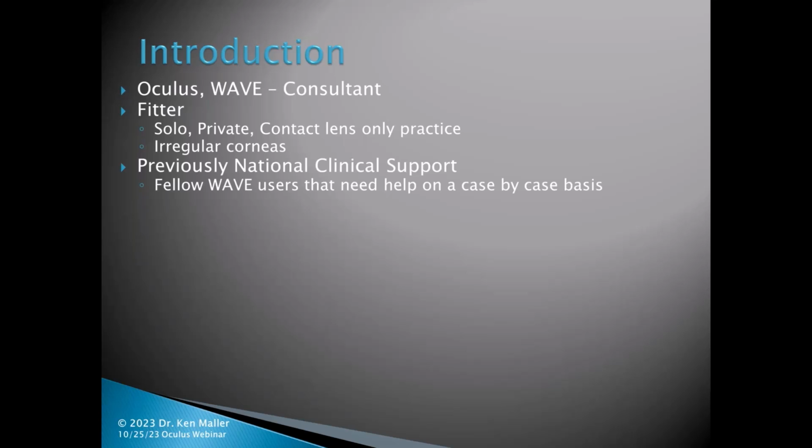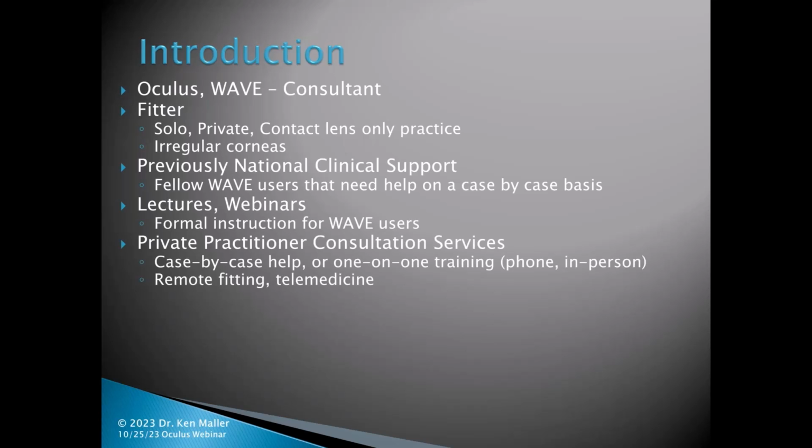I do or have done the clinical support for Wave, but I also do private instruction for Wave users now, and that's through my private consultation services that are available through my website. I do webinars and lectures for Wave users. The private consultation services offer remote fitting through case-by-case help or even one-on-one training through phone and in person to get some Wave doctors up to speed and getting their patients successful.